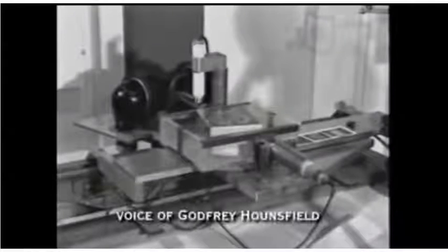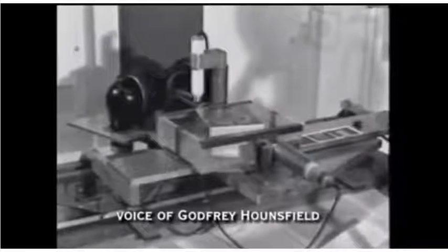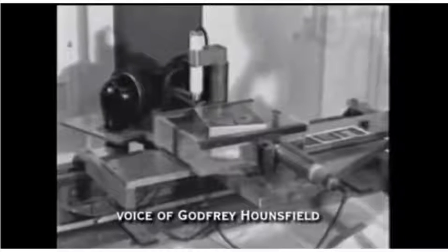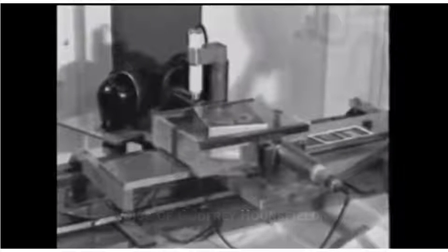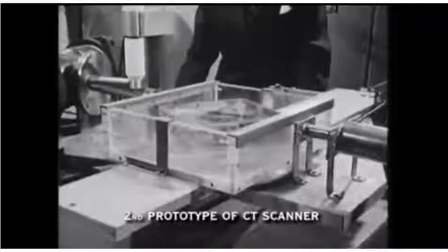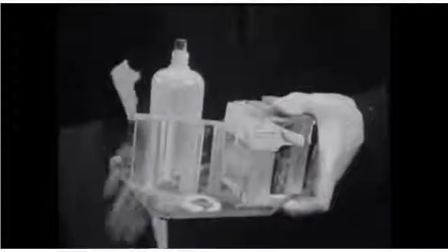As it happened, an old lathe bed was available in the lab, and by using discarded equipment also found around, I was able to build this lab test machine which would demonstrate the principle of the system. Tests begin on a rig built from an old lathe. X-ray data is fed into a computer. Would it show up density differences in animal tissues as well as it does on the Perspex model?